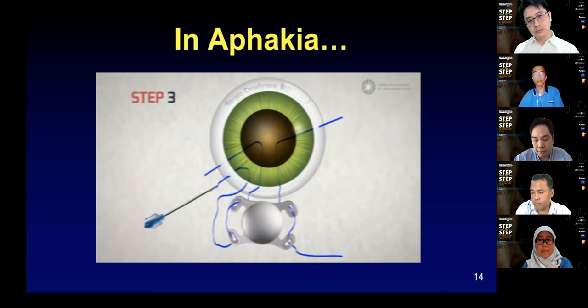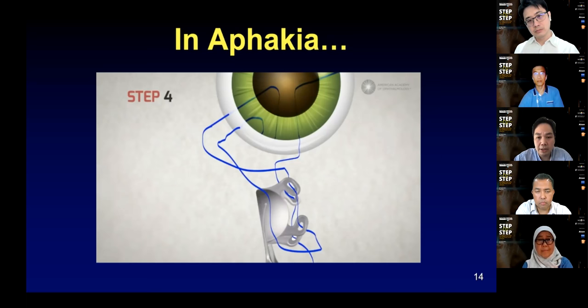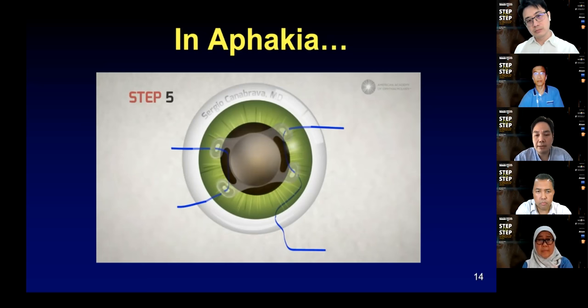So this was when he first published using this Acreos lens. I've not actually tried this. I have had colleagues that like the Acreos lens, but at the time when they were fixating, they were using a Gore-Tex. I just found that there's a little bit too much effort to be looping through the different eyelets, but of course it can be done.